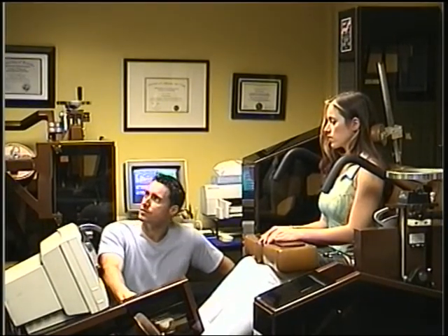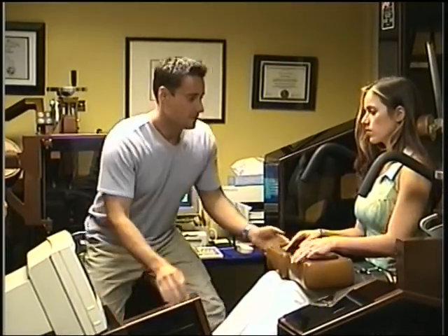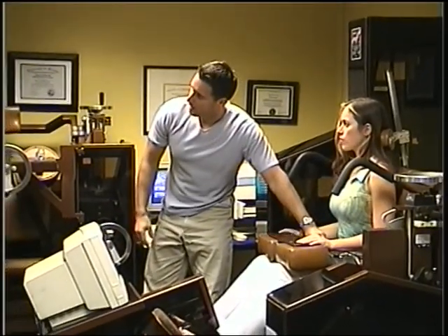Patients from this program were initially tested at the University of Florida, and a lot of the statistics that you see on the equipment itself, they've done ancillary studies to show, again, bone density, hip especially, because the hip is locked into place, but it's isometrically held there. There's still a lot of force and pressures that go through the hip, but it's done under a controlled environment, so it actually creates more bone density for people. But again, the purpose here is to strap down this axis through the hip here, and we do so by holding the upper thigh in place.